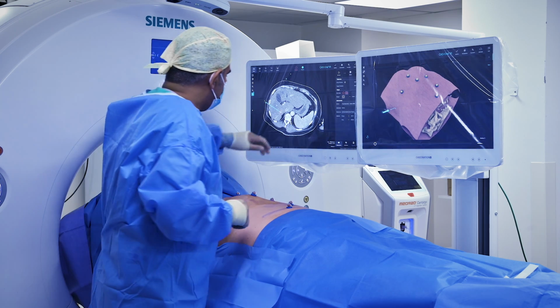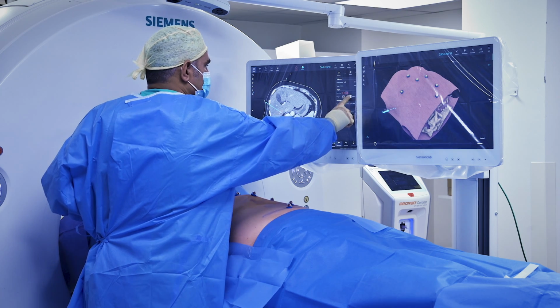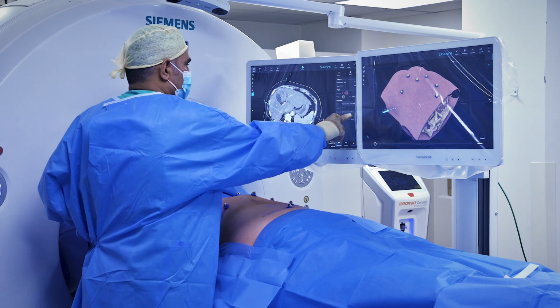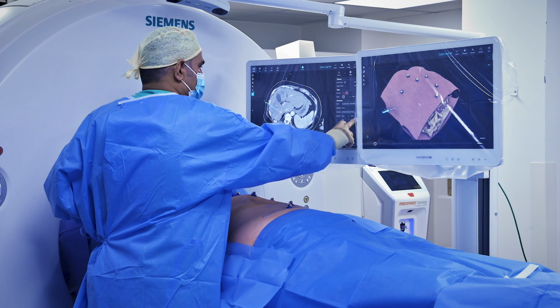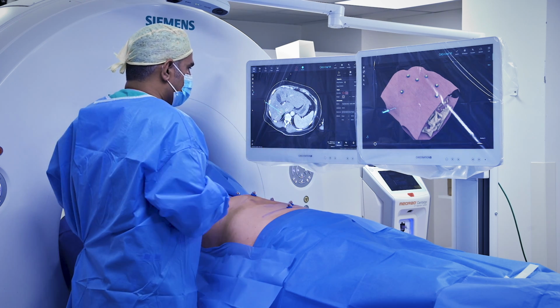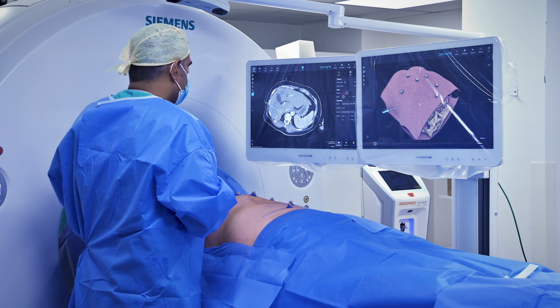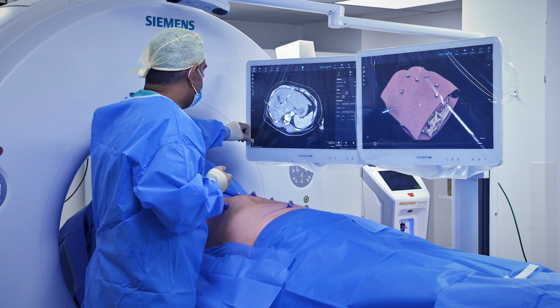So we've got what looks to me, just by visual inspection, a good outline of the tumour. We can see the red circle outlining the tumour, and we can see the margin around it, which is adjustable, which I typically set to 5 millimeters for an HCC. So we've got the microwave probe set up here. What we will do now is just simulate what it would look like with a 140 watt burn for 2 minutes. And we can see the green circle shows that and comfortably covers both the tumour and the margin.